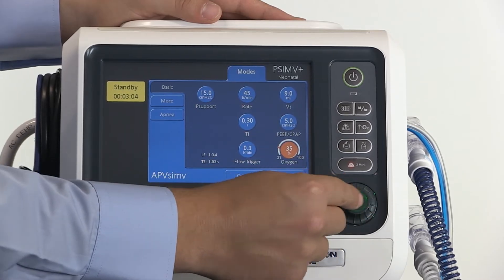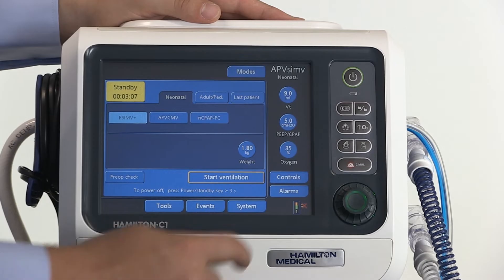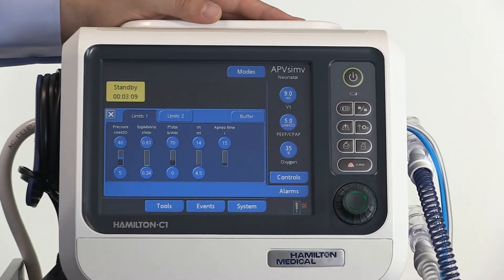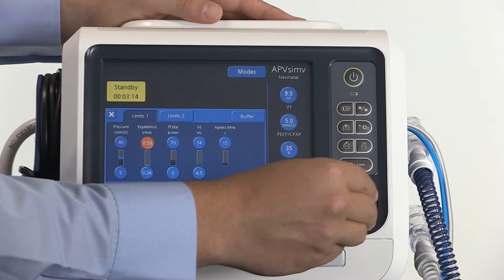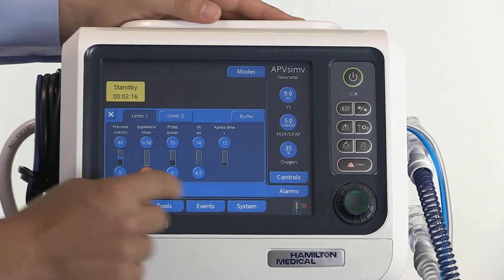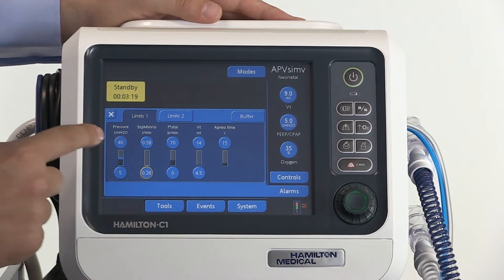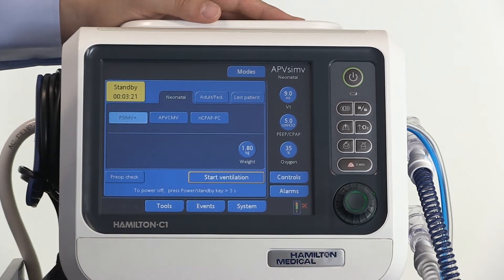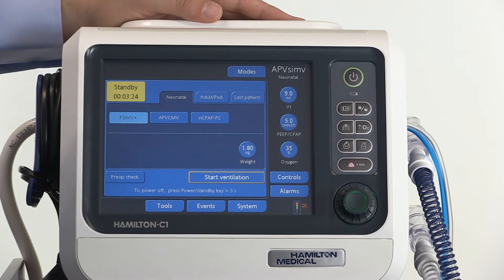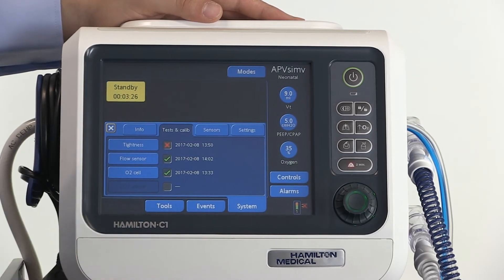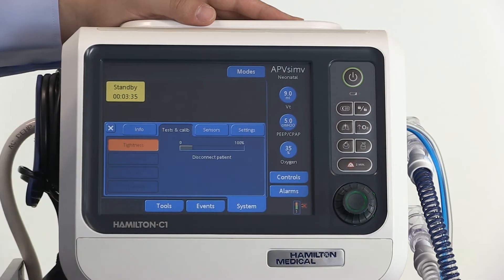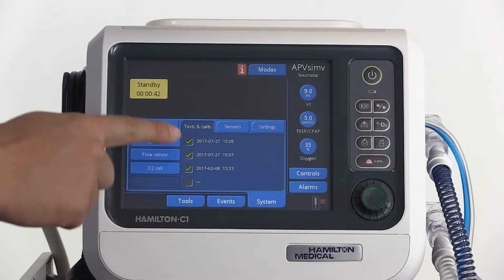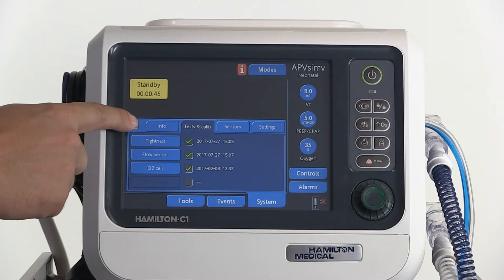Save your changes by pressing confirm. Now you can adjust the alarm settings — open the alarms window. When you have finished, close this window. Now you need to carry out the pre-op check. Open the pre-op check window and carry out the necessary tests by following the instructions on the screen. When all tests have been completed successfully, you can close this window.